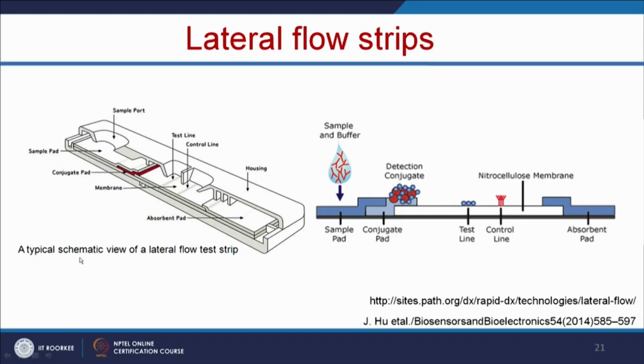This is a typical schematic view of a lateral flow test strip. It has this kind of arrangement. If you open the kit you will have this kind of arrangement.